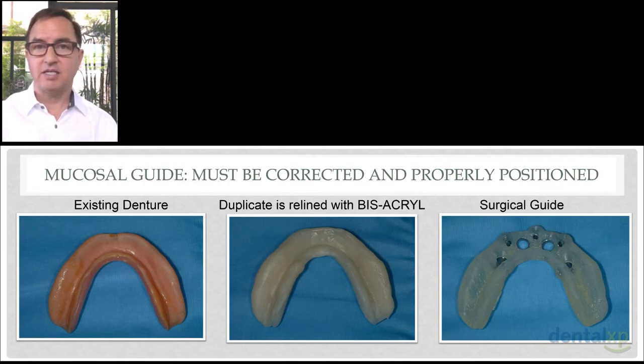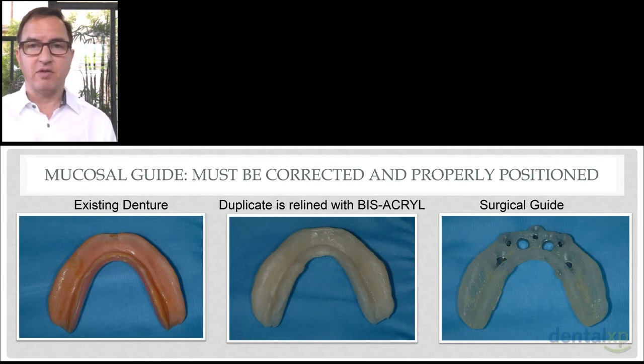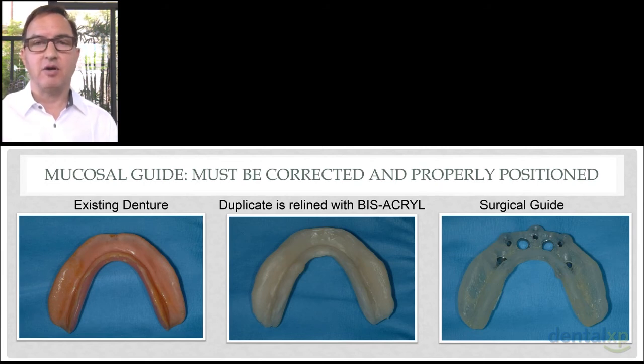If the scan prosthesis is to be positioned in the patient at the time of the making of the scan, then it's critical that it seats properly and is not displaced. If the patient is referred to a scan center and asked to bite on a bite fork, if they're wearing a complete denture as a scan prosthesis, the bite fork could trip it. So they have to either have an interocclusal registration or bite down on cotton rolls or be trained properly, or if the scanning device is in your own office, you can better manage the position of the scan prosthesis.